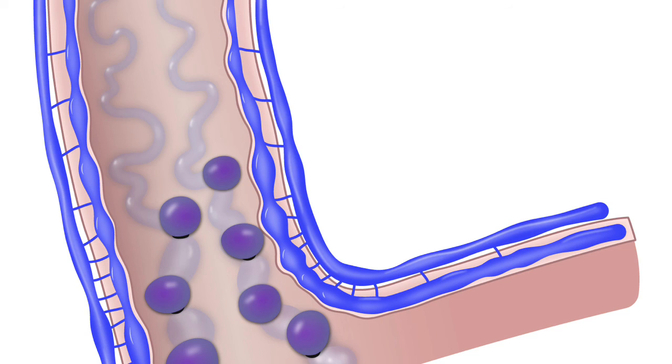So we have learned about how to set up the band ligator. We have learned about the importance of the two-way position and firing position. Once the band ligator is set up, as a technician, when you give it to your endoscopist, the endoscope band ligator handle should be in a two-way position.